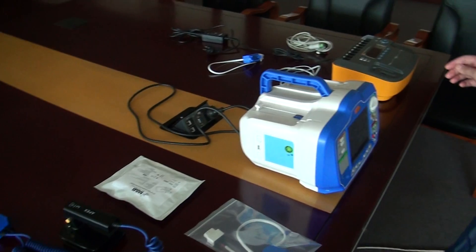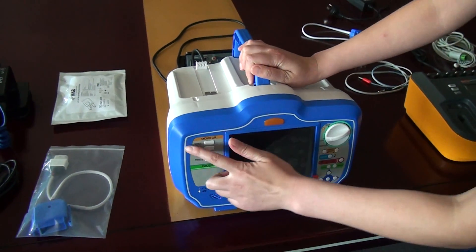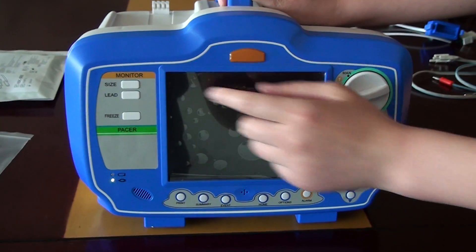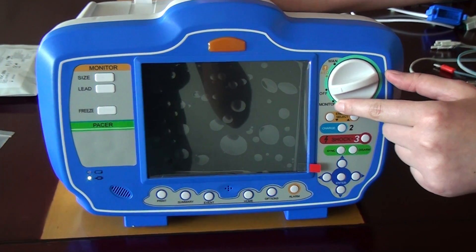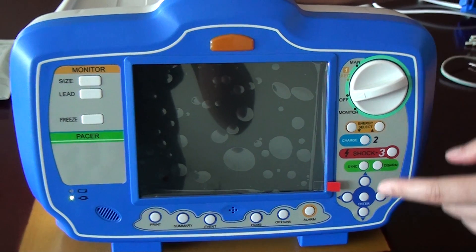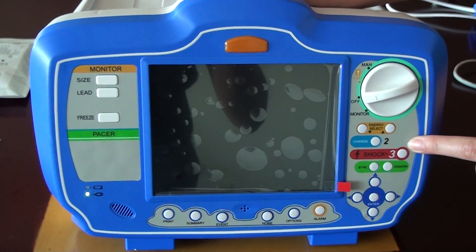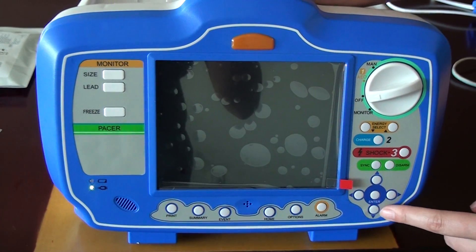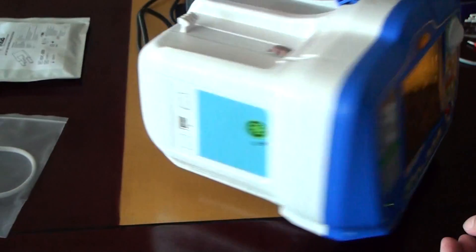Now we make an introduction for our device. This section is used for the monitor. For this knob, you can choose the monitor — turn on or off — AED and manual. And for these buttons, they are used for the defibrillator. And these buttons are for operation.